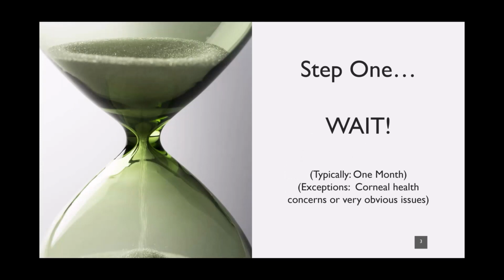One thing I always want to start off with when I'm talking to my student externs about changes that we might make in a lens, or if a lens is just not seeming to fit quite right, I always caution them: let's not make a change too quickly.